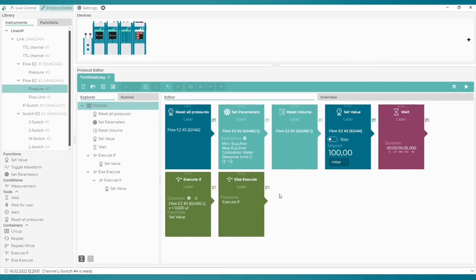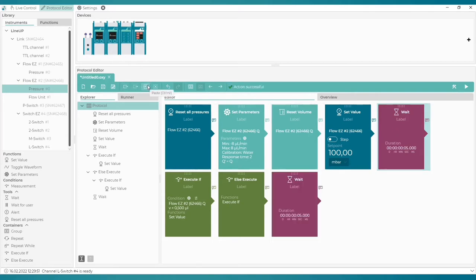Let's also copy the Wait block at the end, so that the result can be properly presented on the graph. That's it. Let's run the protocol and see how it turns out in the Overview tab.